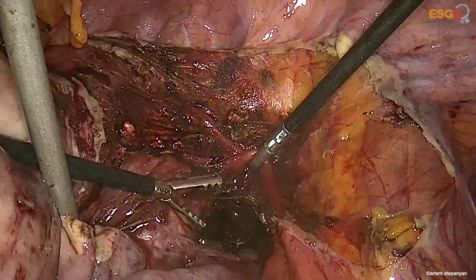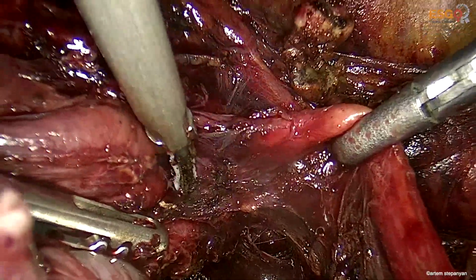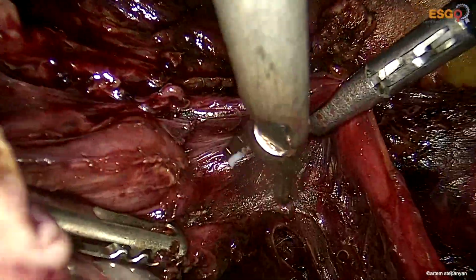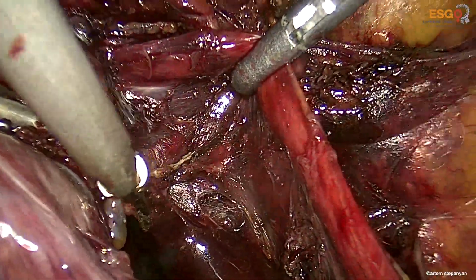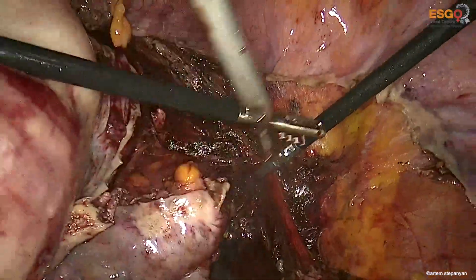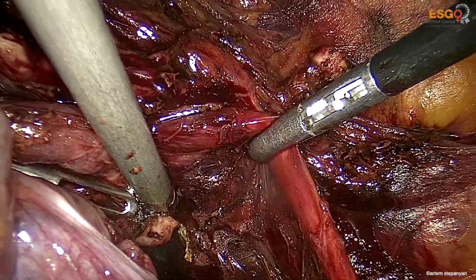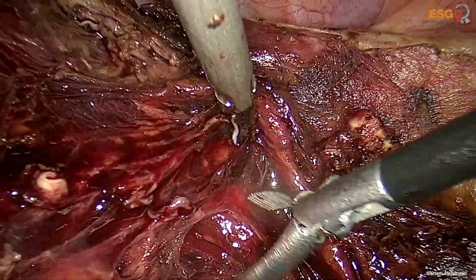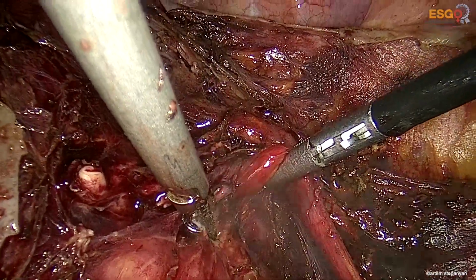For this purpose, we combine the traction, counter-traction, we will visualize the mesoureter and bluntly and sharply dissect the ureter with the mesoureter off the infiltrated peritoneum of the right portion of the Douglas's pouch, and at the same time dissecting off the tumor and the infiltrated peritoneum from the underlying tissues.